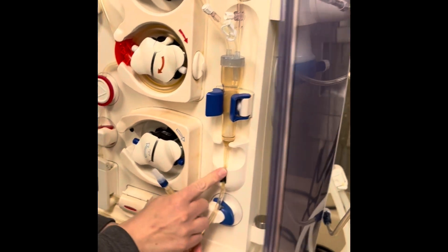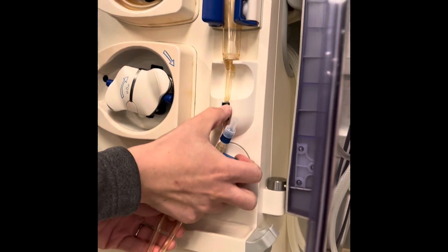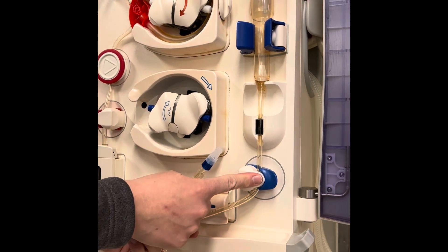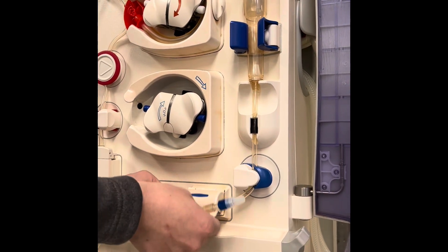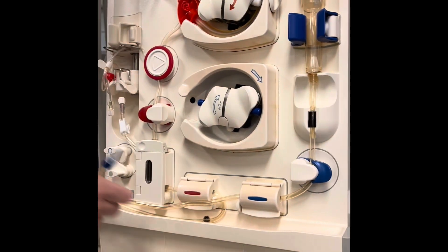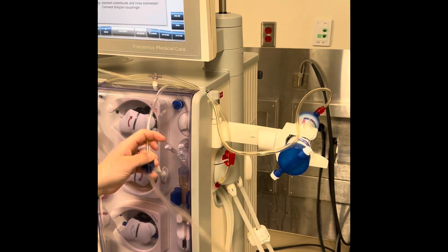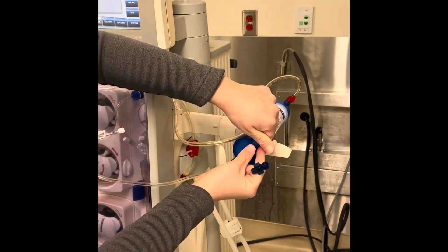Here on the end of your venous line you also have a medication port — clamp that as well. I'm going to make sure it's really fitted in here because this is where it's going to detect any air bubbles entering your patient. Then attach to your venous clamp, your BTM door, and to your patient side. I'm going to completely attach this blood tubing to my dialyzer.